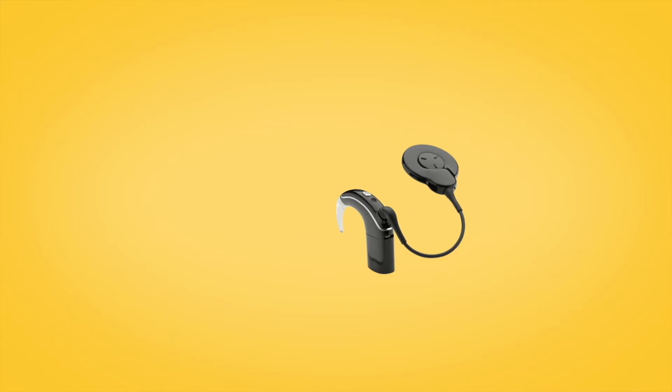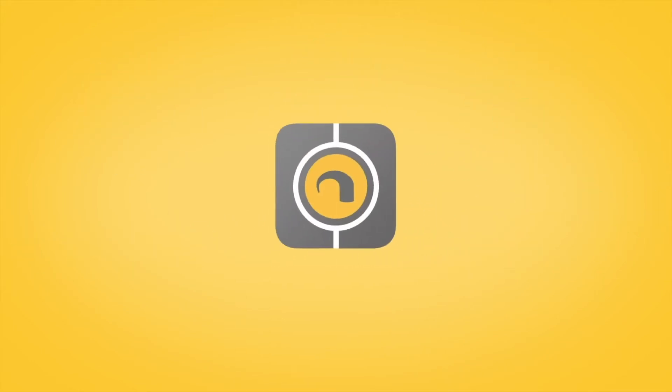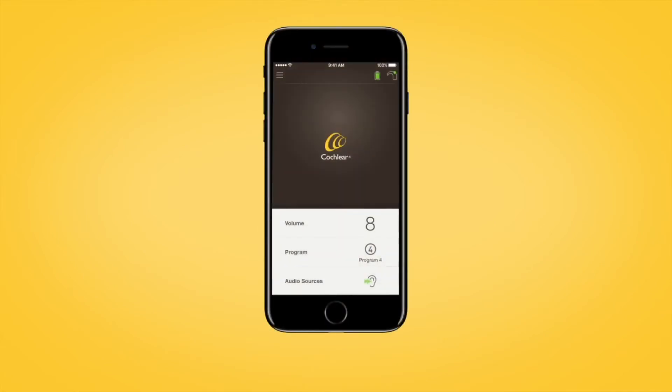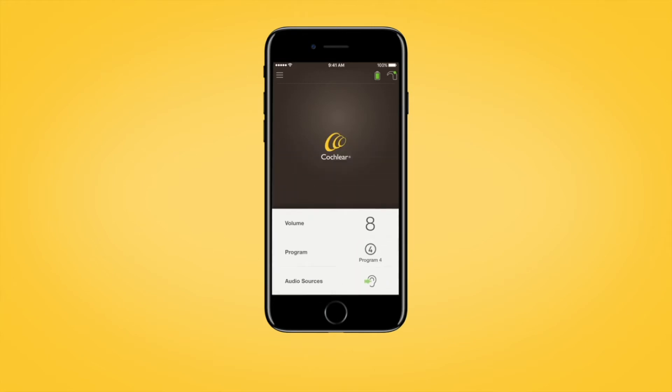When your Nucleus 7 or Kanso 2 sound processor is paired with a compatible Apple or Android device, you can control streamed audio using the Nucleus Smart App. Open the app and tap the audio sources on the app home screen. In the audio sources control panel, tap the icon for the audio source you want to use. Tap off to stop streaming audio and return to the previous program.